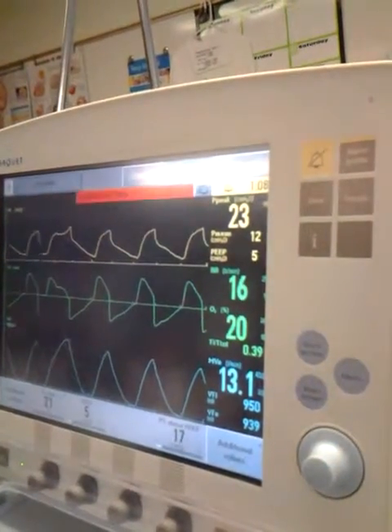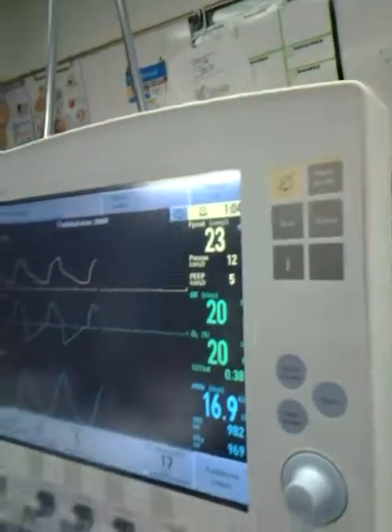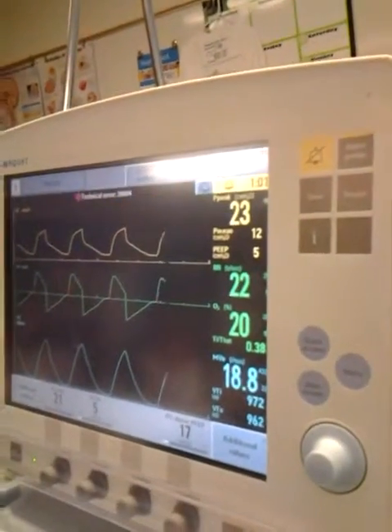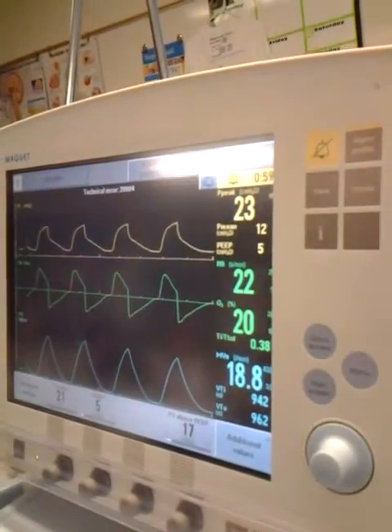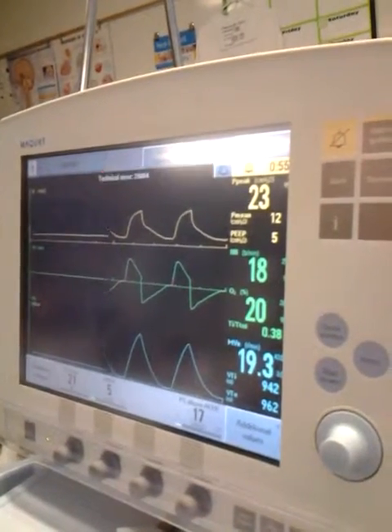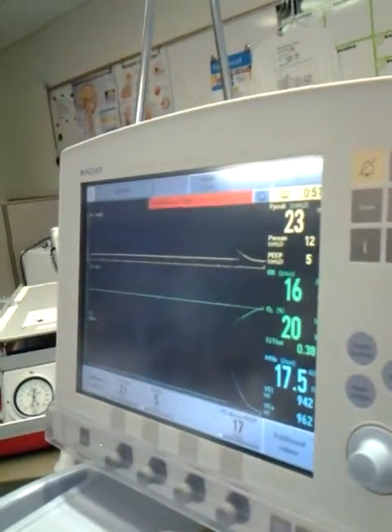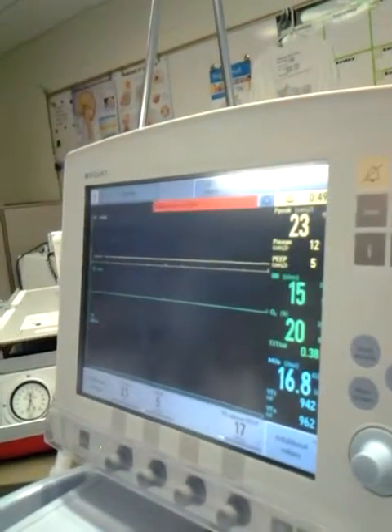Do you understand what just happened? If that happens throughout the night and you're not in the room with them, you'll know because you would have to look at the log to see how many times. And if that happens too often, then they're not ready to be on spontaneous.